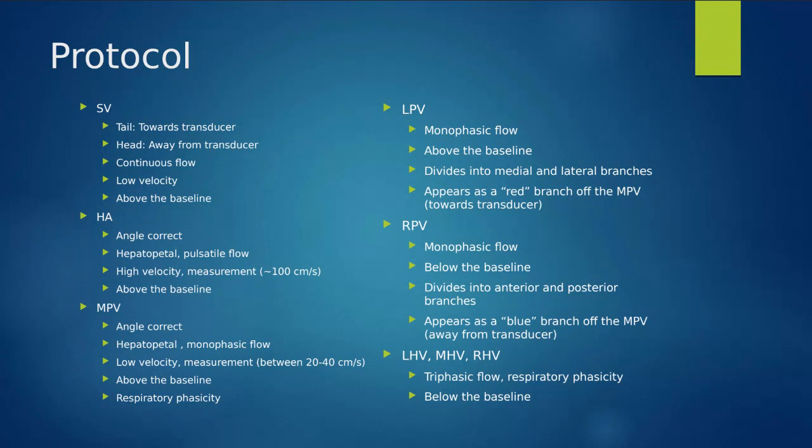When we talk about phasicity of a waveform, that means how many phases does it go through? When we have an arterial pulsatile vessel, the arteries are undergoing that rapid contraction of the heart, right?